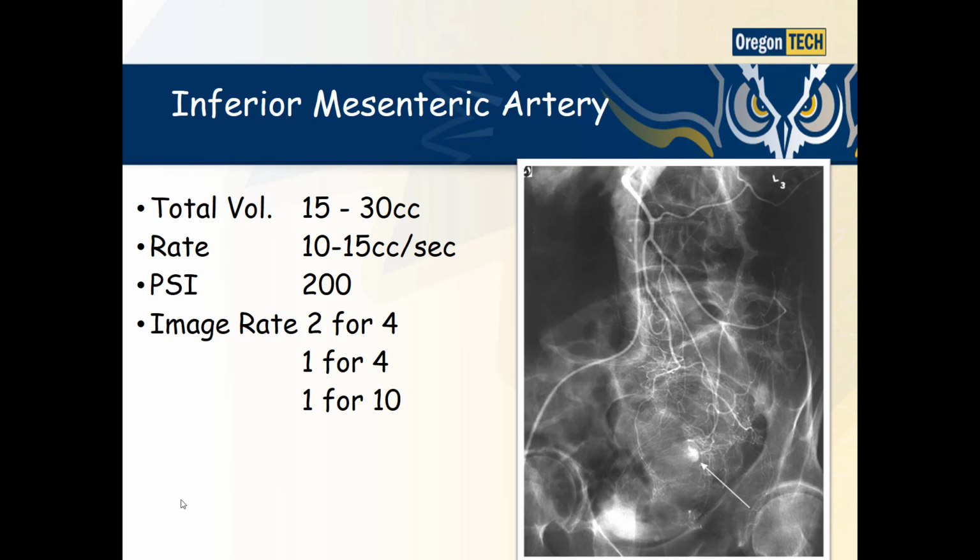Now this has been inverted. In other words, we turn black to white and white to black, and so what you're seeing here is contrast media in the inferior mesenteric artery. You can see right here they have an AVM, that's an arterial venous malformation. So the blood doesn't go across the capillary beds. It just goes to the arterioles, and then it goes into the venules.